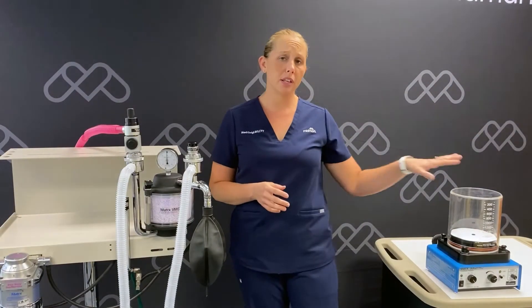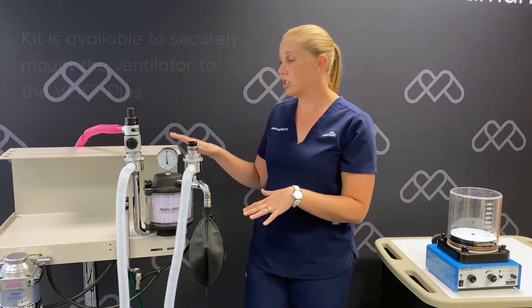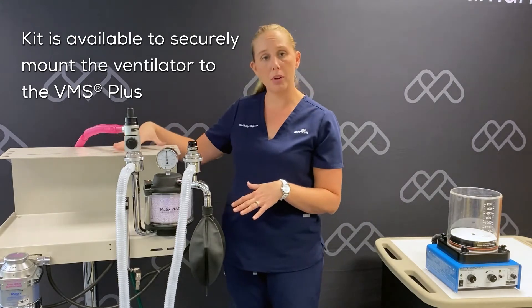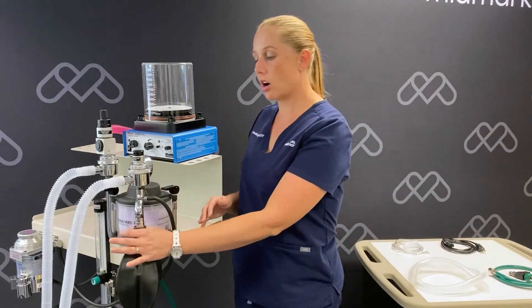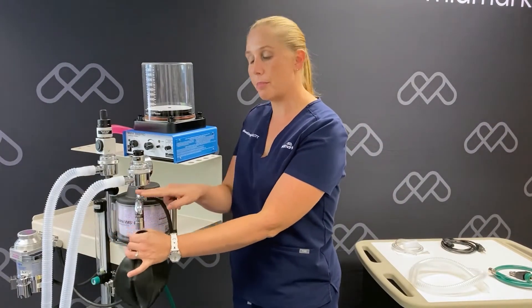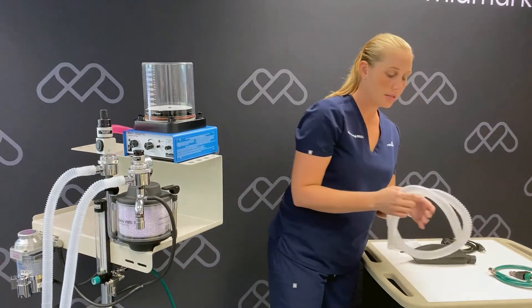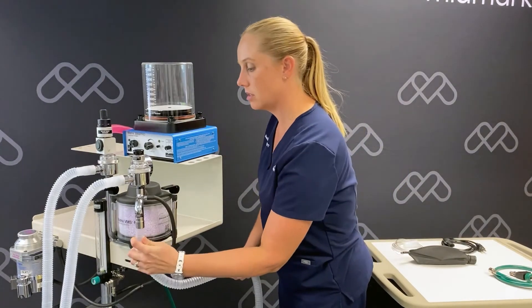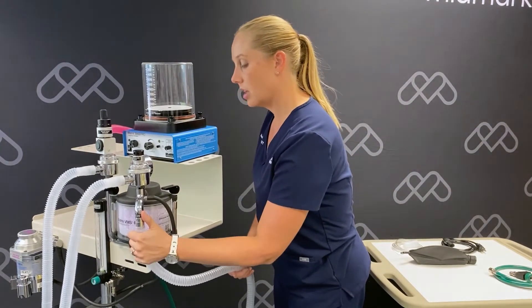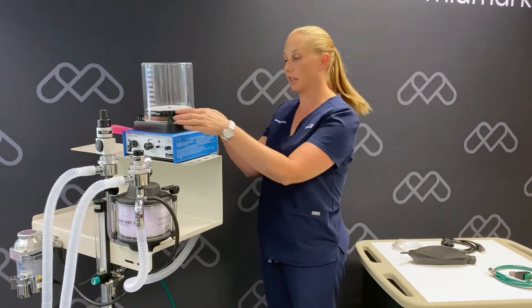We're now ready to place our ventilator onto the anesthesia machine. For this particular machine, we're going to place the ventilator on the top of the upper shelf near the absorber head. Our next step, we will take our bag off of our reservoir bag arm. In its place, we're going to place the clear corrugated tubing on one end, and the other end will go to the breathing system port on the back of the ventilator.